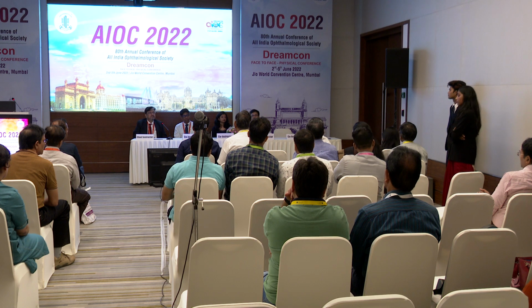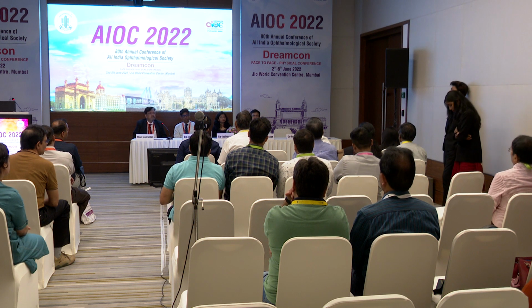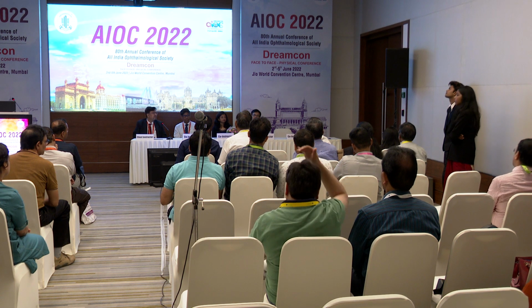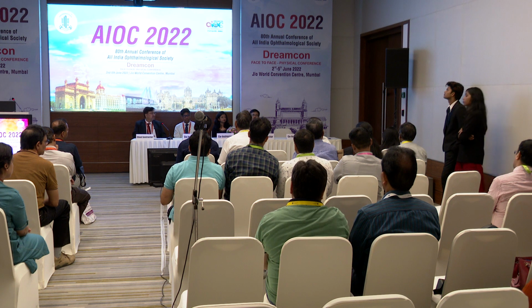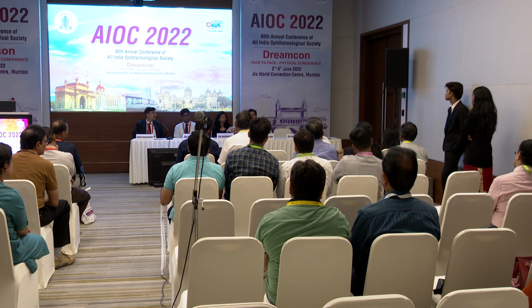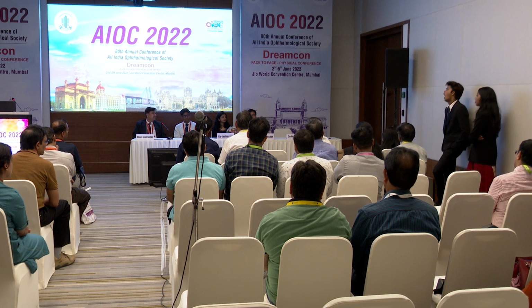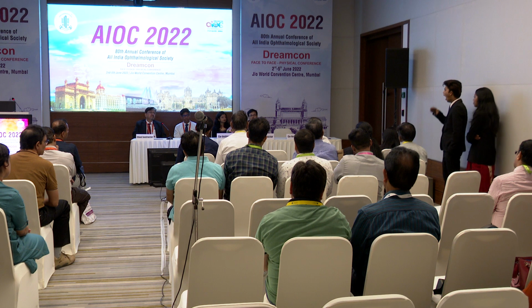One thing we have not discussed in this session is the water that you are going to use for autoclaving and cleaning of instruments. That is another area of controversy. I had worked in one OT in which there were 4 taps, and Pseudomonas aeruginosa would grow alternately from one tap. One month it would come clear, the next month it would grow, again it would be clear, again it would grow, and those were being used for instrument sterilization. And the problem of Pseudomonas aeruginosa is that it is not easily killed by your autoclaving process.